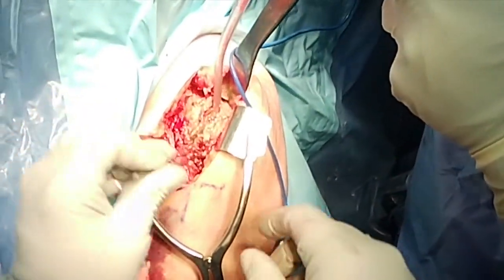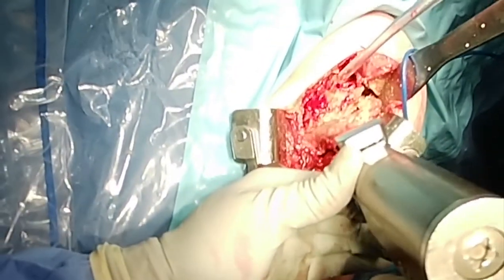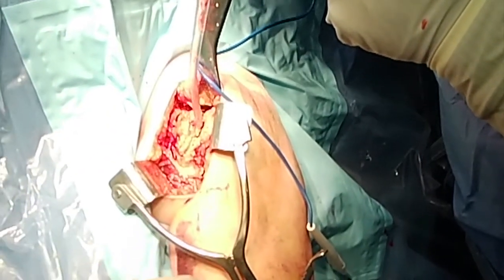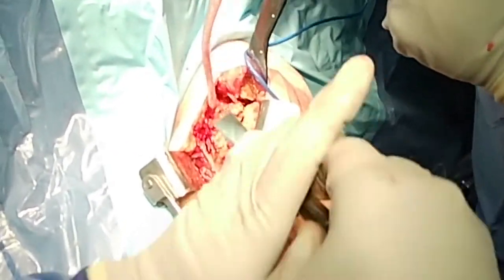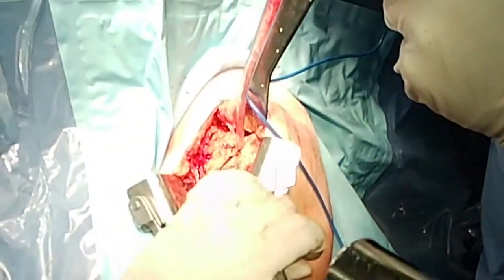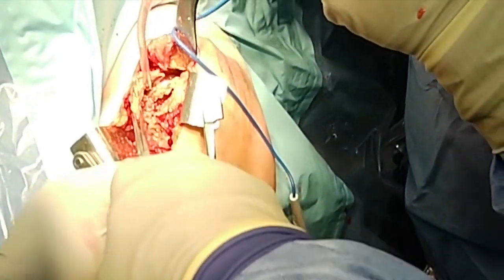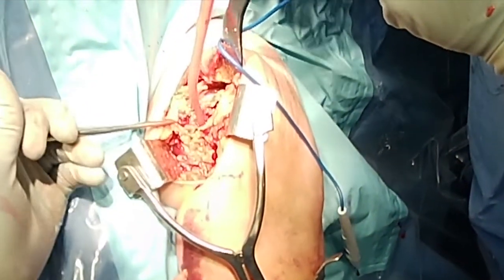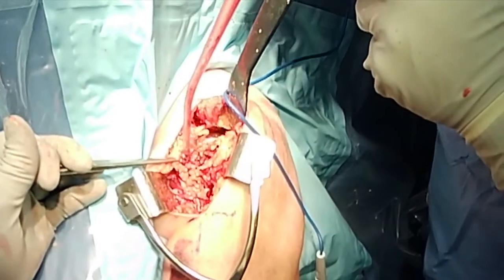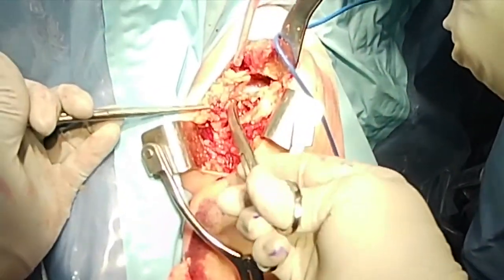Once I have done adequate release, I use a saw to osteotomize the lesser tuberosity off the prosthesis. In this situation, because I am doing a reverse and stem implant, the thickness of the lesser tuberosity is not critical. But if you end up taking a thick chunk, I would advise that the lesser tuberosity is debulked, otherwise wrapping it around the stem can be difficult.